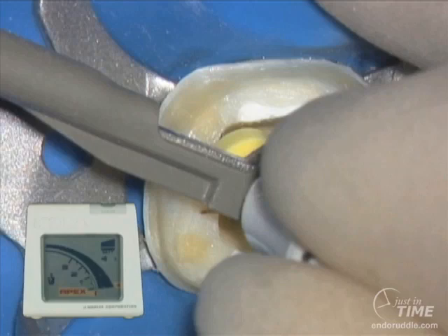I'm not working 1 millimeter short or 1/2 millimeter short. I'm actually working to the apex, which means you'll get an audible noise and you'll also get a light flashing. So 3 things will confirm you're where you want to be: the digital readout, the audible beeps, and the lights flashing.